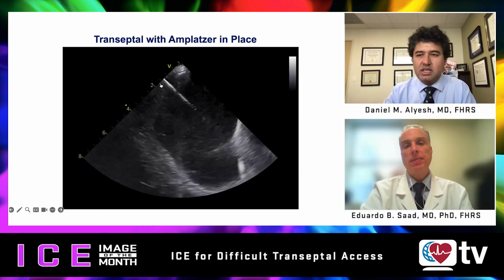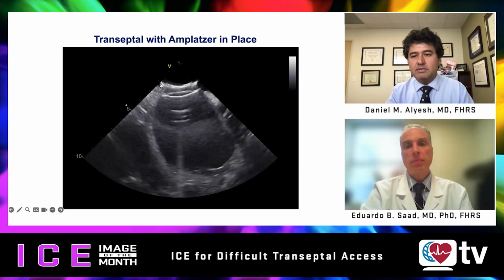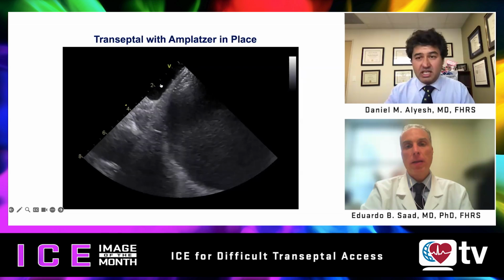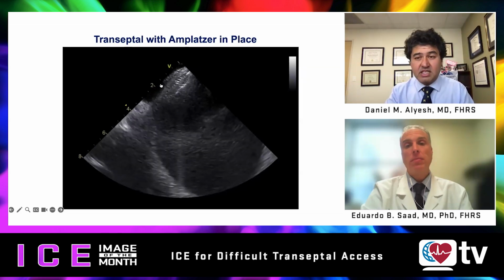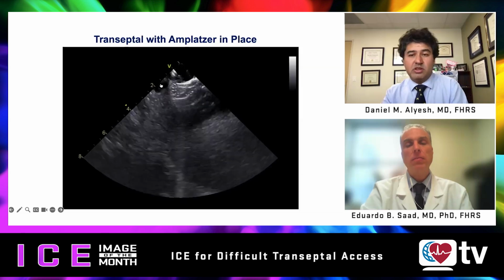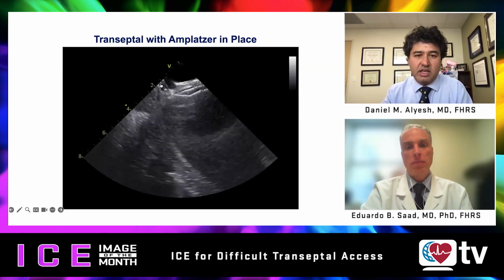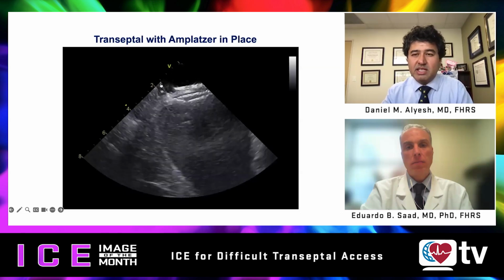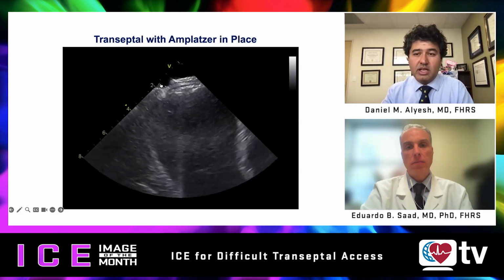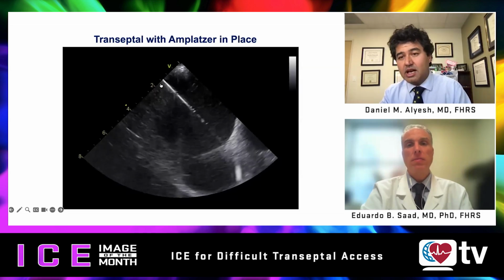I think you can still see the tenting, regardless, from a safety perspective, right? Injecting saline to know you've accessed the right chamber, as well as advancing your wire so you know where your apparatus is going to go, all critical for safety. And really, you can make something that can be anxiety provoking quite technically challenging yet interesting with this approach.